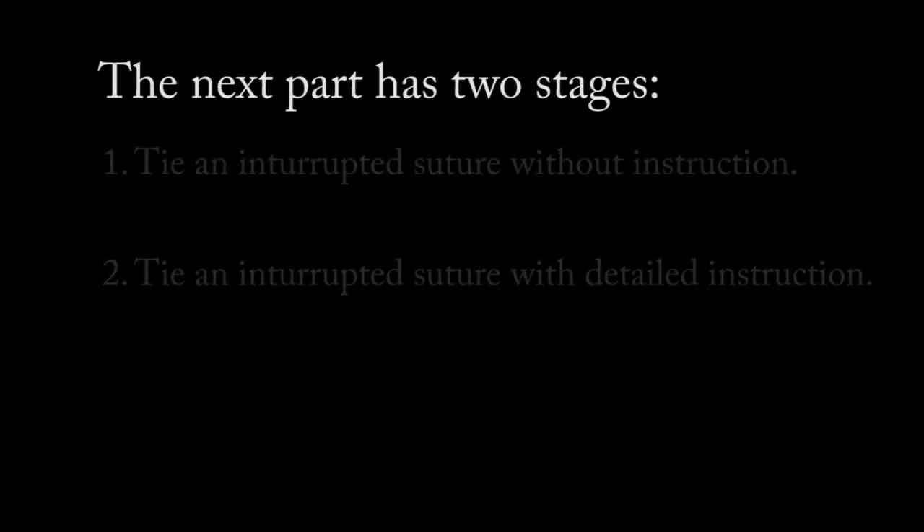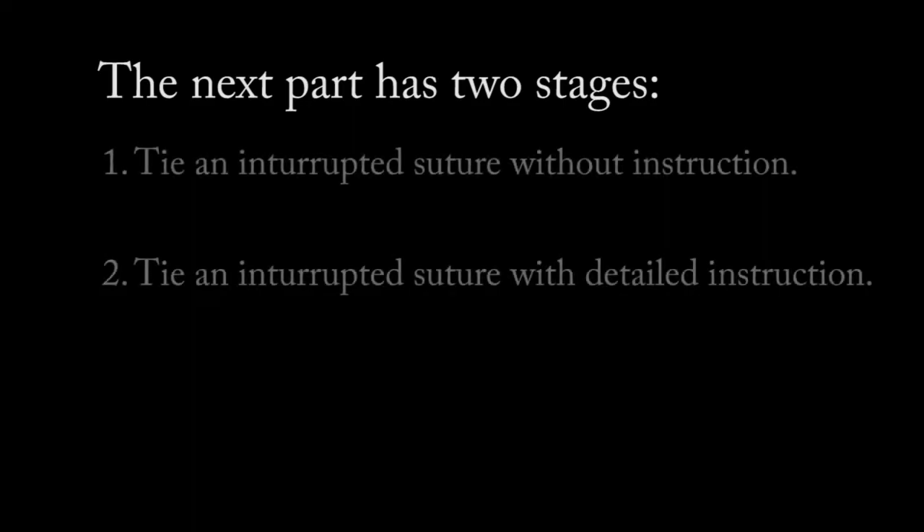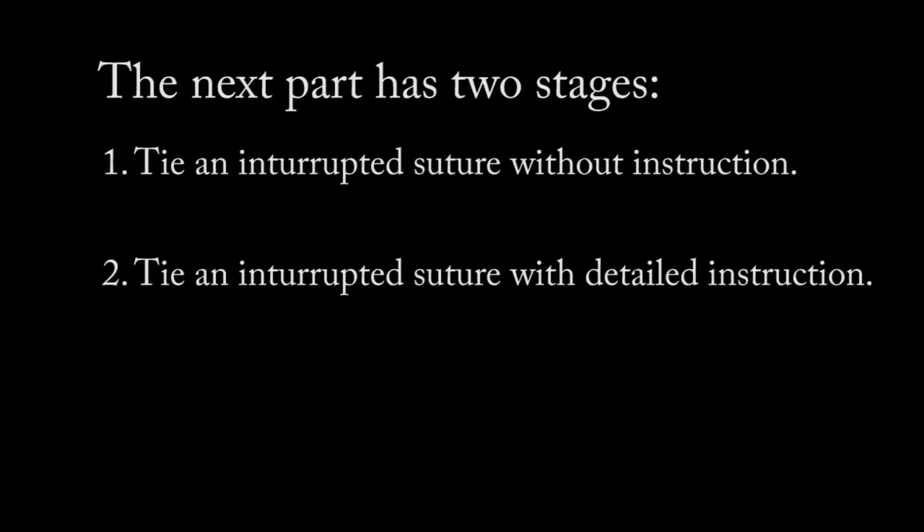The next part has two stages. I will tie an interrupted suture without instruction. Then, I will tie a second interrupted suture with detailed instruction.